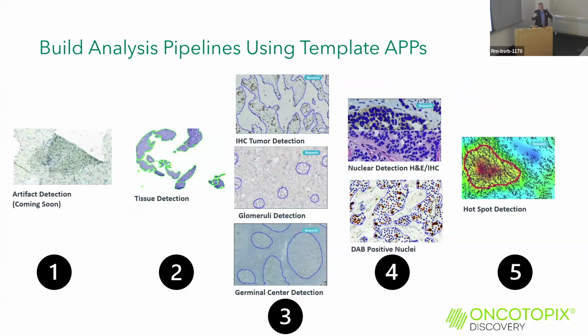And you can string together the sequence that you would like this to work, so you can batch process that across the larger data set. These are also all modifiable. It may not work perfectly for your data set, but you can simply add some more information or make some changes to what it's found in order to perfect it to your research and your science.